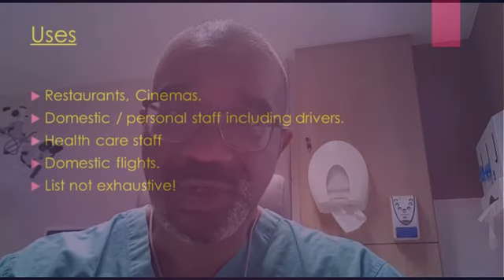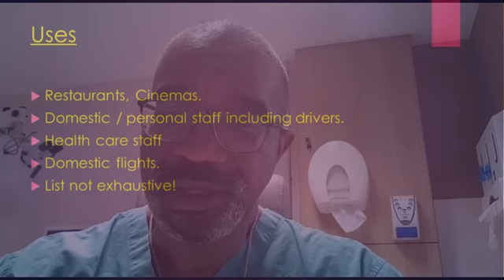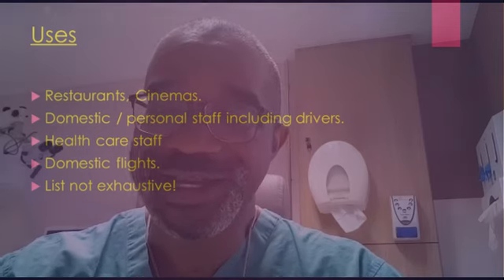Ideally, this test should be done twice a week, just to ensure that you have a good way of identifying those patients that may potentially be carrying the infection.